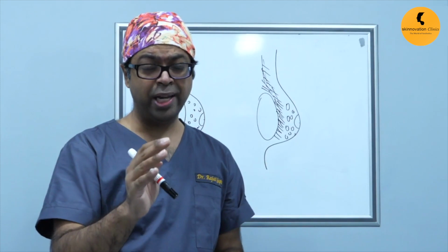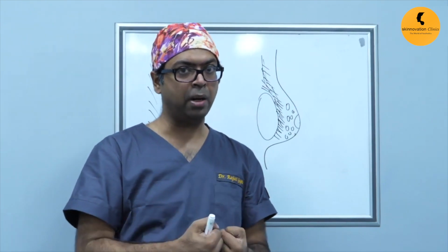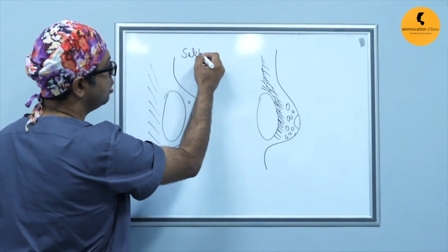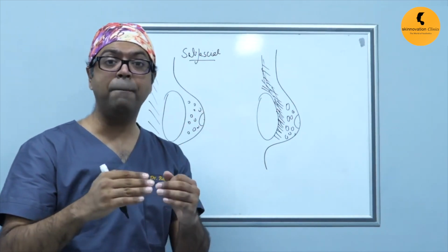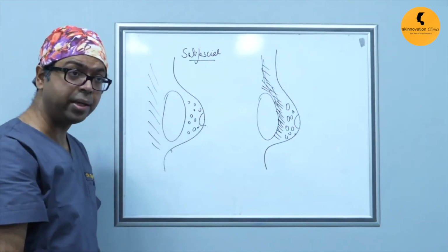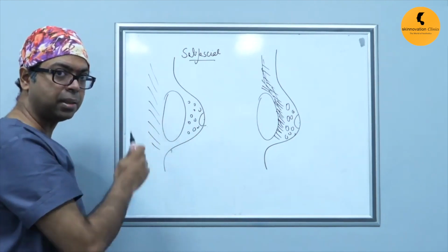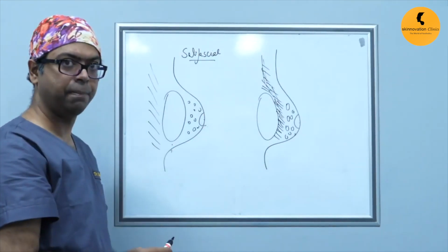Breast implants, as you know, is one of the most common cosmetic surgery done for the breast for females. There are two planes in which we can put an implant. So, what are these two planes? One of the planes is called Sub-Fascial, or beneath the pectoral fascia but above the muscle. In this technique, whether we go from periareolar or inframammary, we go behind the breast tissue and put in the implant in front of the muscle. This implant is placed ahead of the muscle.